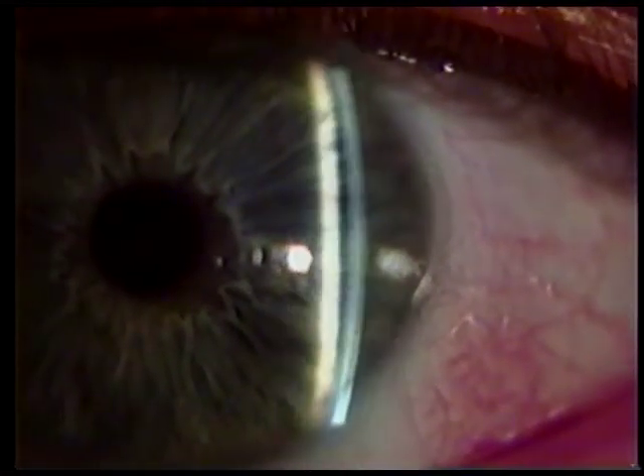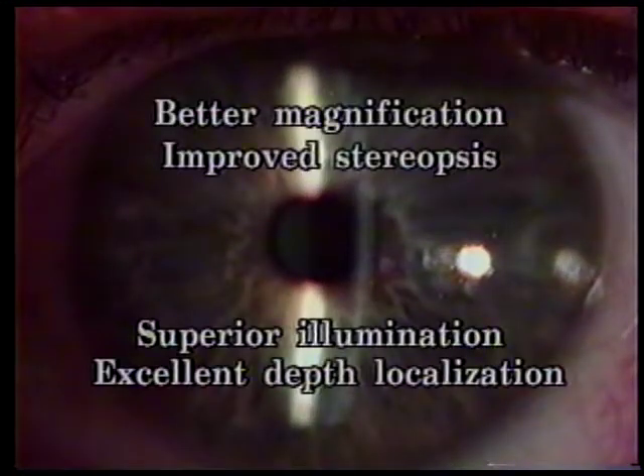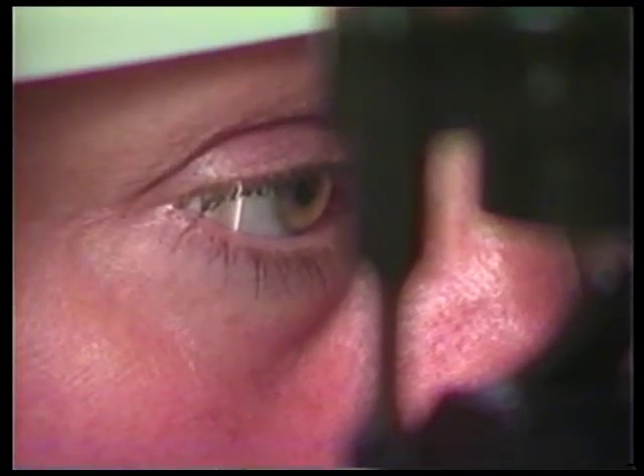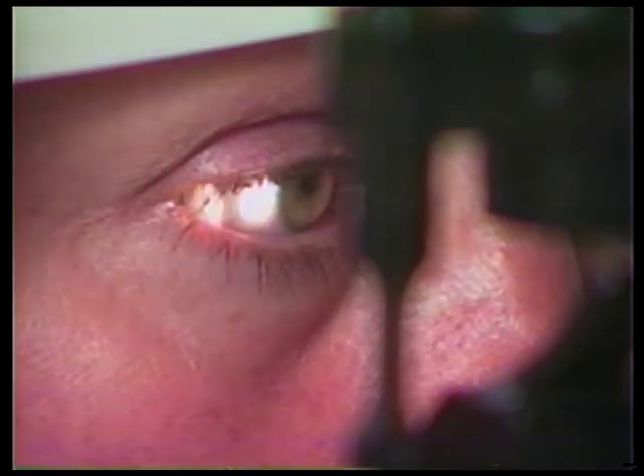Slit lamp biomicroscopy has four advantages over loop observations: better magnification, improved stereopsis, superior illumination, and excellent depth localization. The slit lamp produces a very bright and focused beam of light that can be varied from a hairline slit to an eight millimeter wide beam or to a small spot beam of light.